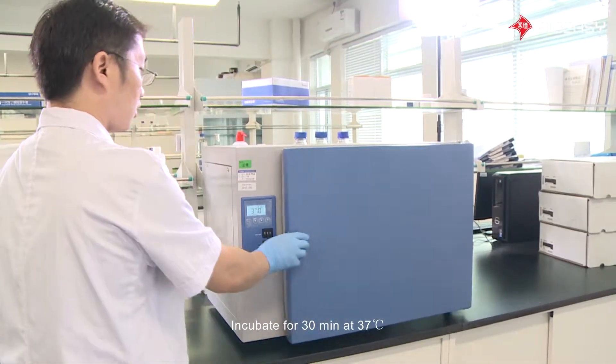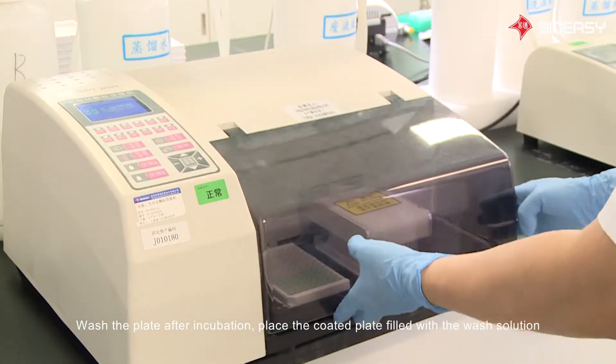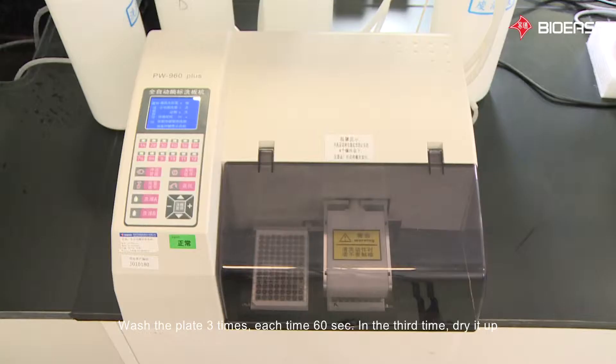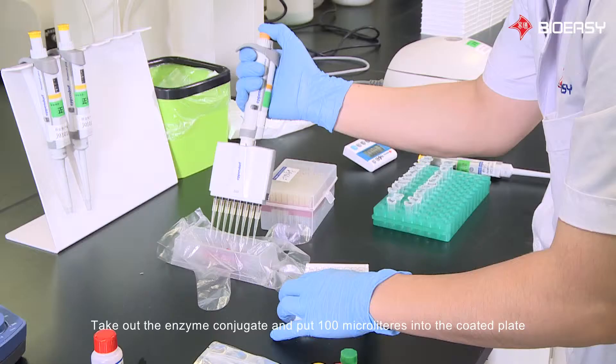Incubate for 30 minutes at 37 degrees Celsius. After incubation, wash the plate: fill the coated plate with wash solution and wash three times, each time for 60 seconds. On the third wash, dry it up.